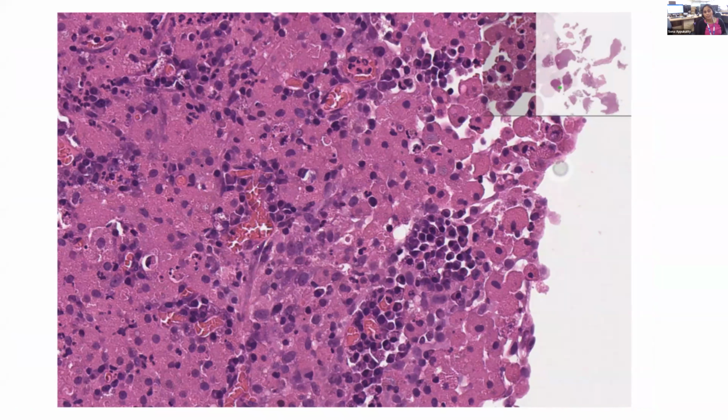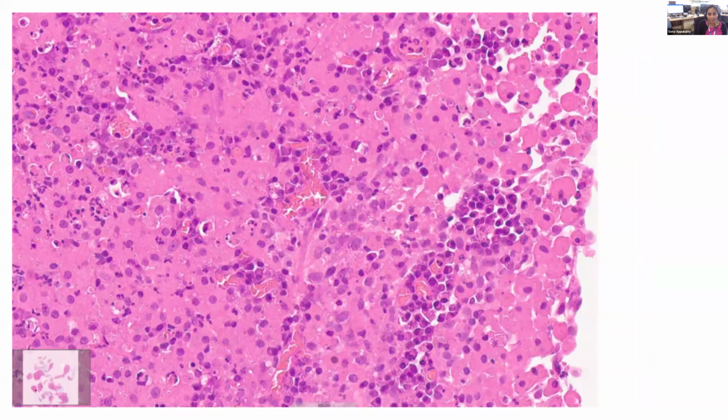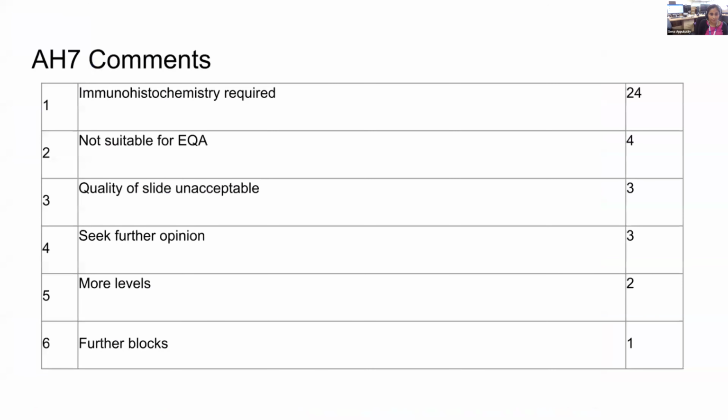Just a bit of foreshadowing here. When we look at the capillaries, we can see the red blood cells are disc-shaped or biconcave. I know what you are thinking. You're on the right track. Just a shot from the Oxford website also, showing the Michaelis-Gutmann bodies, so that if one has used the Leeds or Oxford site, those inclusions were there in both the sites.